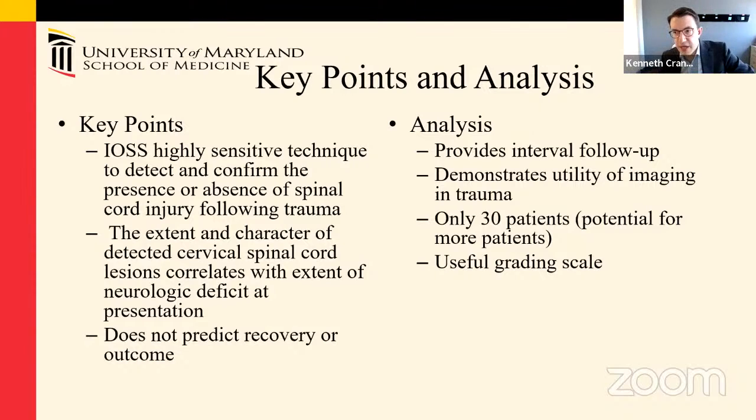The one comment that I'll make is I think that if you see a highly echogenic lesion in a patient who has had a spinal cord injury, a lot of times it is probably a hematoma. I mean, it is pretty easy to see on ultrasound.